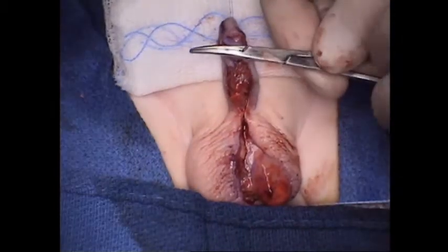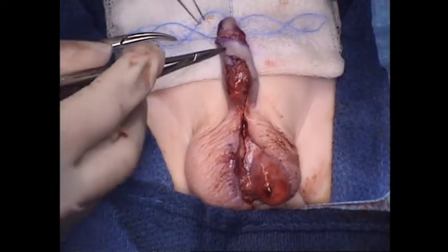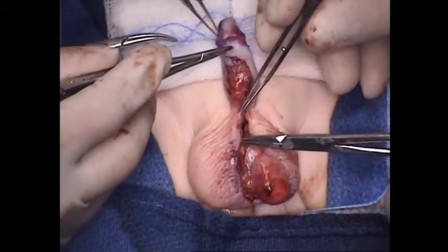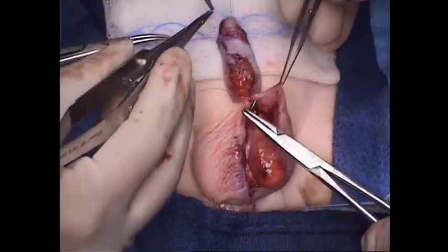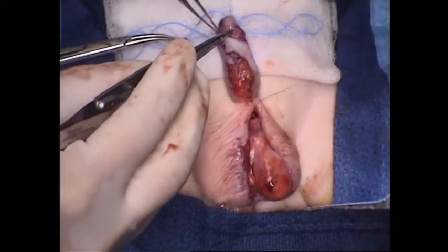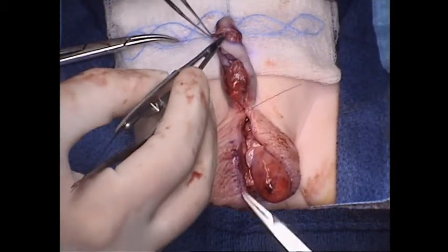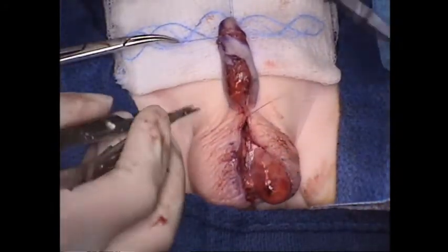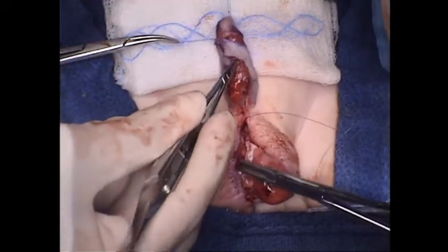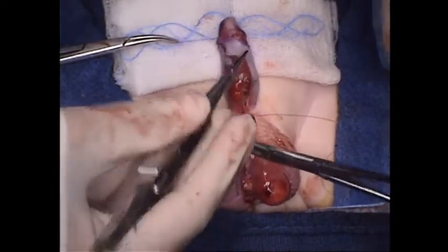Mosquito. Especially right here, because people tend to take big bites and they leave a train track appearance. And then in order to get rid of that, if you've made a train track with epithelial sutures, you have to excise some of the scrotum as well.